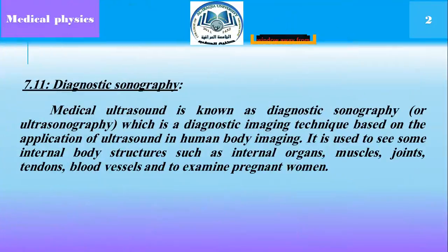Diagnostic sonography. Medical ultrasound is known as diagnostic sonography or ultrasound sonography, which is a diagnostic imaging technique based on the application of ultrasound in human body imaging.